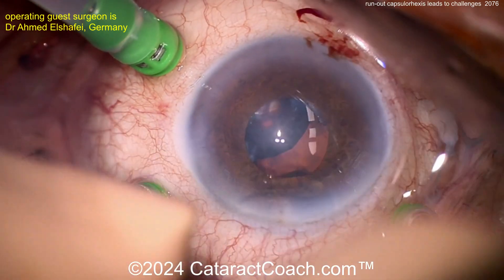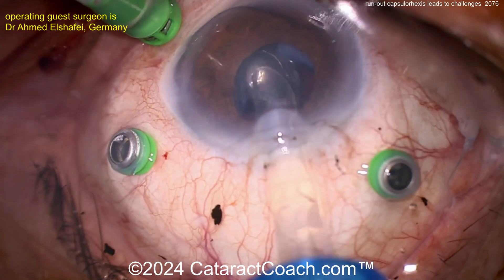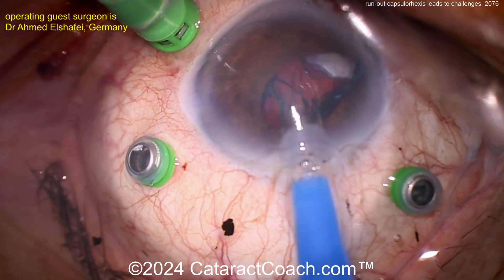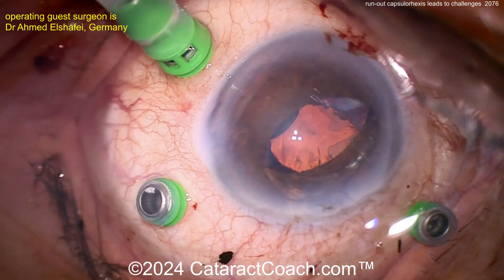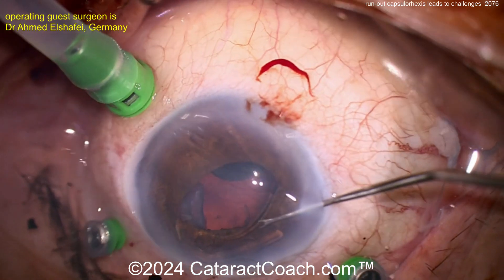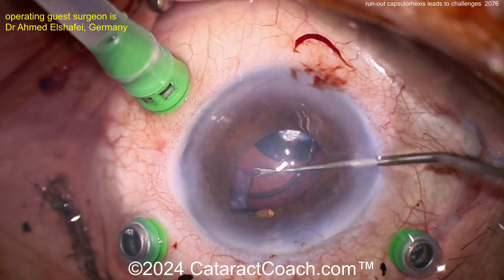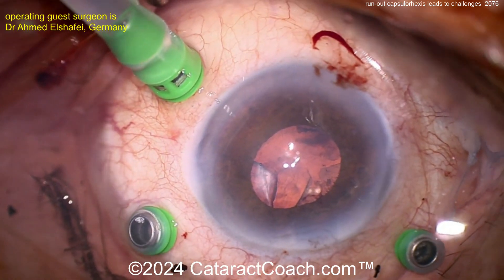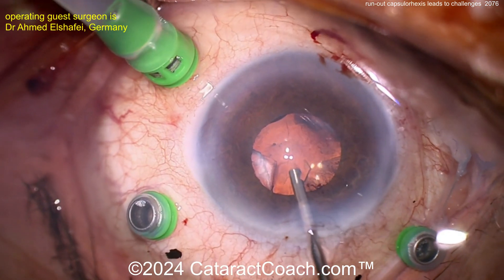Looks like a single-piece acrylic lens being loaded up. Getting that inside there — there's the leading haptic, hopefully that flipped over. It looks okay. There's a capital letter L for the trailing haptic, so maybe it's the correct orientation. Now let's get that delivered. Is it going in the bag? Probably, with a single-piece acrylic — but there's still some lens material back there. I hope the capsule is sufficiently supported.